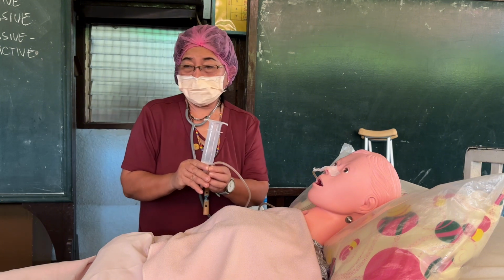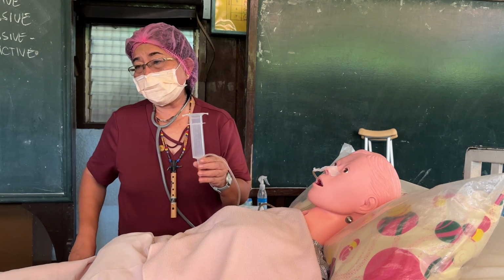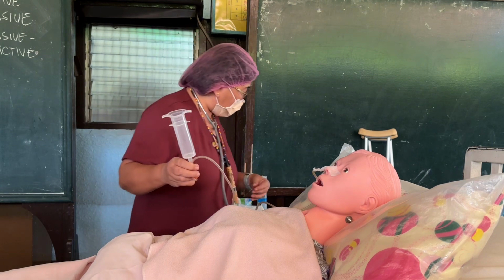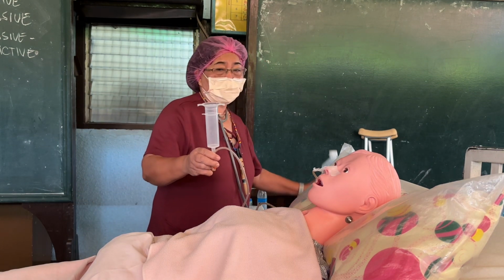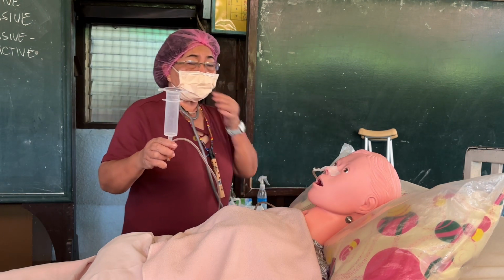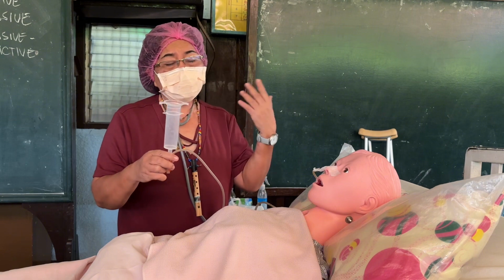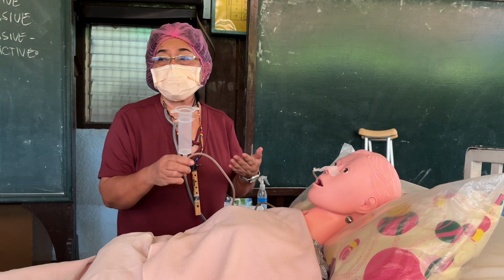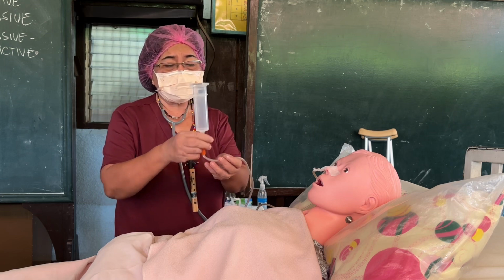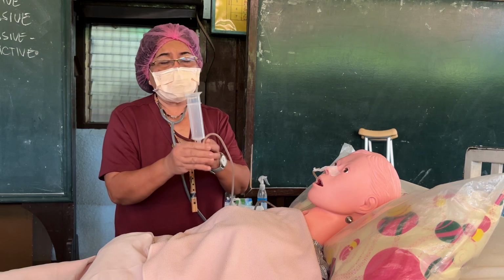How many ml is left? Just 10. Okay, so you flush the remaining 10 ml of water. Divide it into 3. So if you will notice, every time you introduce medication, you always flush with water. Every after feeding, you flush with water. Okay, it's flushed. I'm done.